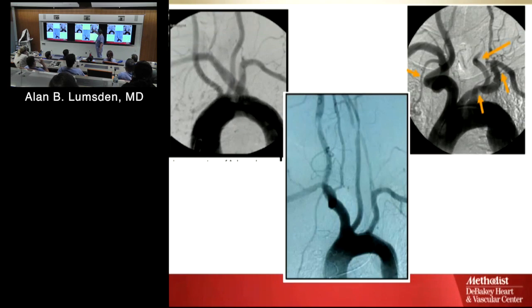Okay, what artery is that? Pretty easy when it's laid out like this. It's a piece of cake. Now they're diseased. The problem is you're all going to be diseased, the ones you're going to be looking at. So what is that? Your right common carotid. So again, the bifurcation is probably here, but you can't really tell when they're loopy like this. Very difficult to lay out the bifurcation to be exactly sure where it is. Internal mammary. Okay.